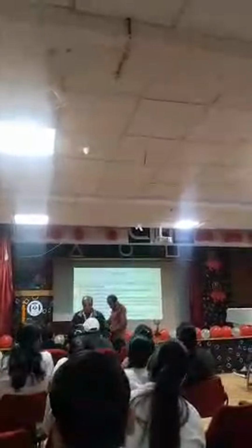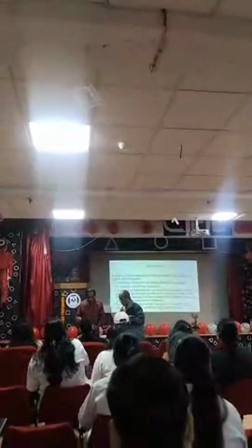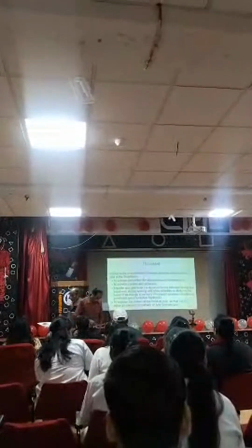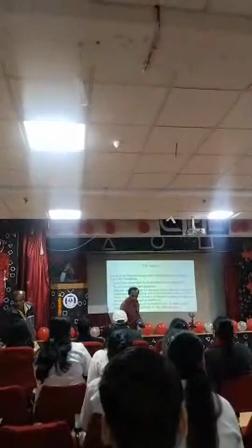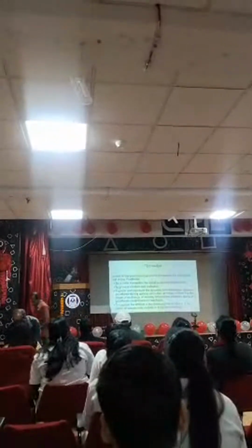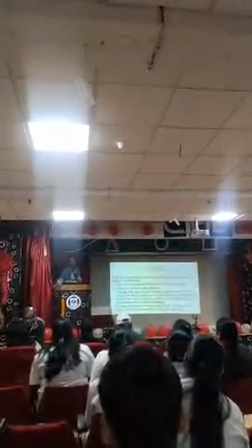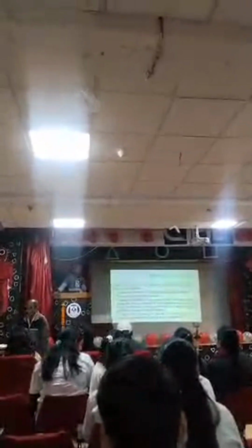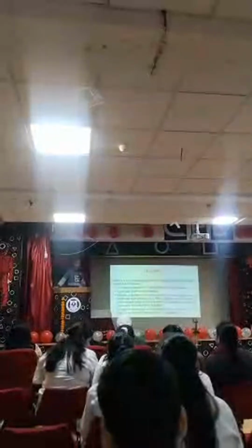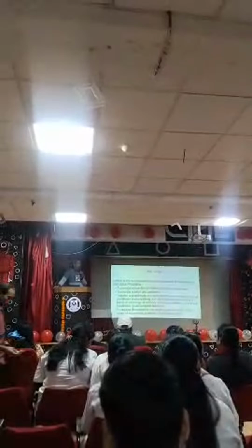Prosthesis parts means all the parts. It could be the shank and the foot in the case of transtibial. In the case of transfemoral, it could be the knee, shank and foot. But mainly the socket is basically the connector. It's a connection, just like our joint. We can say that the socket is kind of a joint, but it's a pseudo joint, because we do not actually want to have it as a joint, but it is working like a joint.